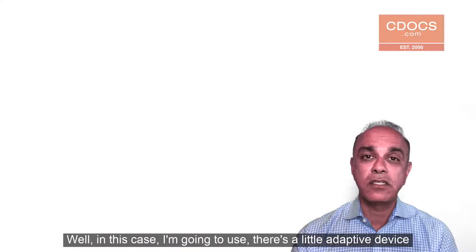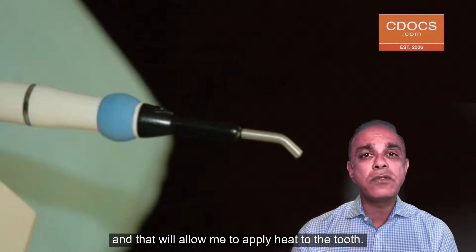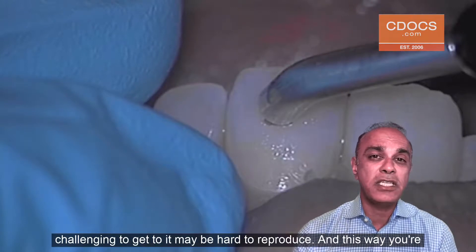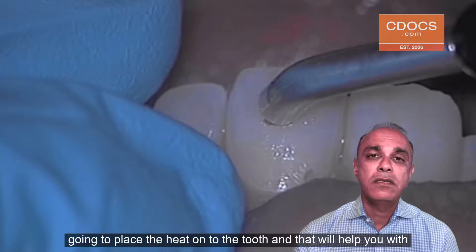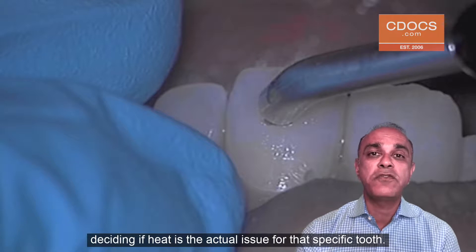I'm going to use a little adaptive device that I attach to the Calamus unit, and that will allow me to apply heat to the tooth. It's a really easy way to introduce heat to an area that may be challenging to get to, and may be hard to reproduce. This way, you're going to place the heat onto the tooth, and that will help you with deciding if heat is the actual issue for that specific tooth.